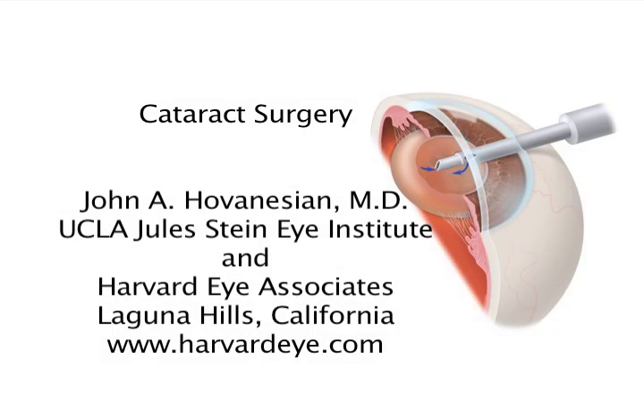Hi, I'm Dr. John Hovenessian. In this video, we'll take a look at how we perform modern cataract surgery using small incision techniques with phacoemulsification ultrasound and the use of an accommodating lens implant called the crystal lens.